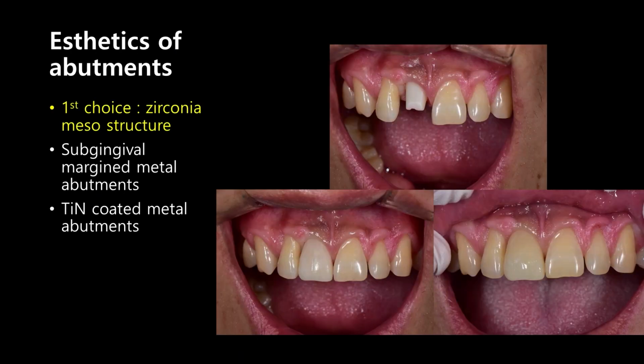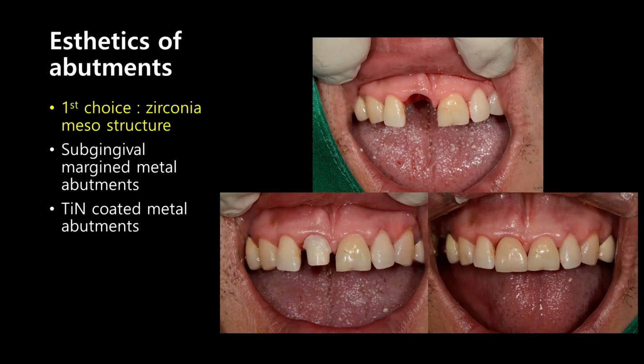Next case, again, on top of gingiva, temporary abutment is used, and bottom side, you attach temporary, and the right bottom is final crown. So gingiva shadow looks rather natural. And this case also the same. Here, I did it in my early days, so abutment design-wise, it's not that elegant.